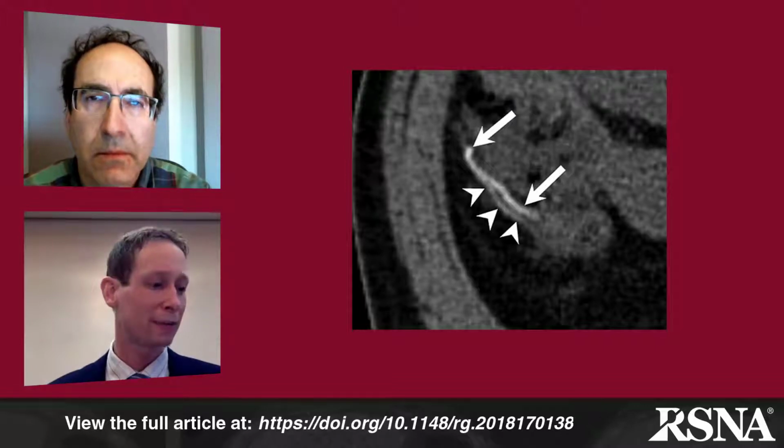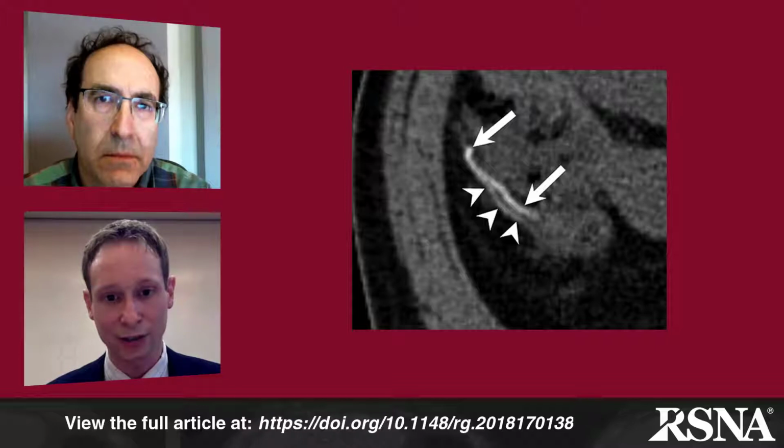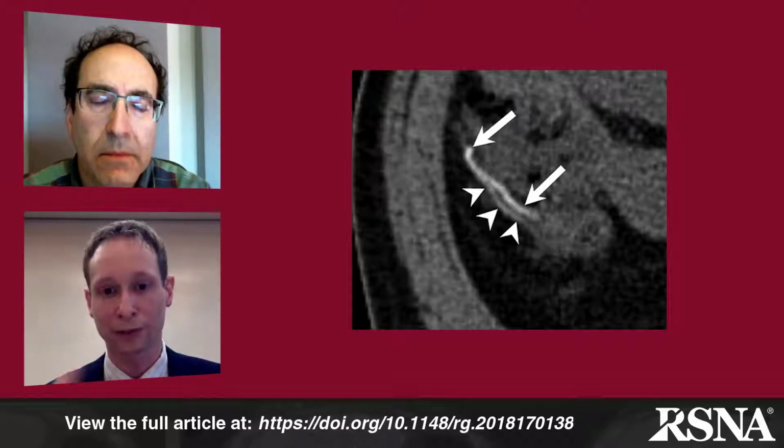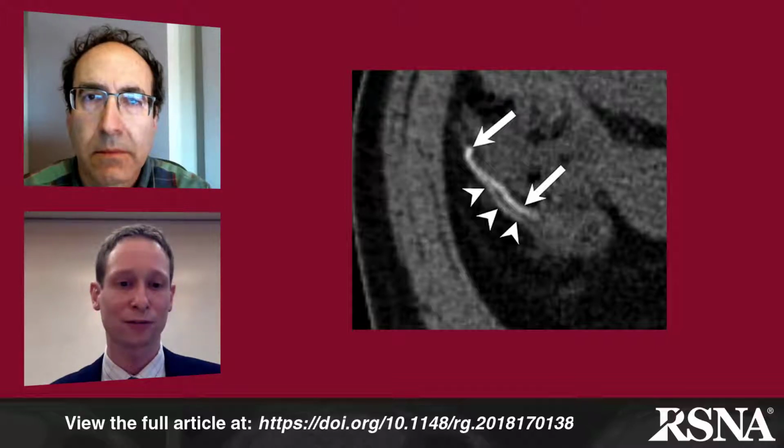And so with AVMs, the findings we expect to see would be a feeding artery with a central nidus of enhancement, with or without active extravasation. And since there is no capillary network associated with these, opacified blood is rapidly shunted into the venous system.